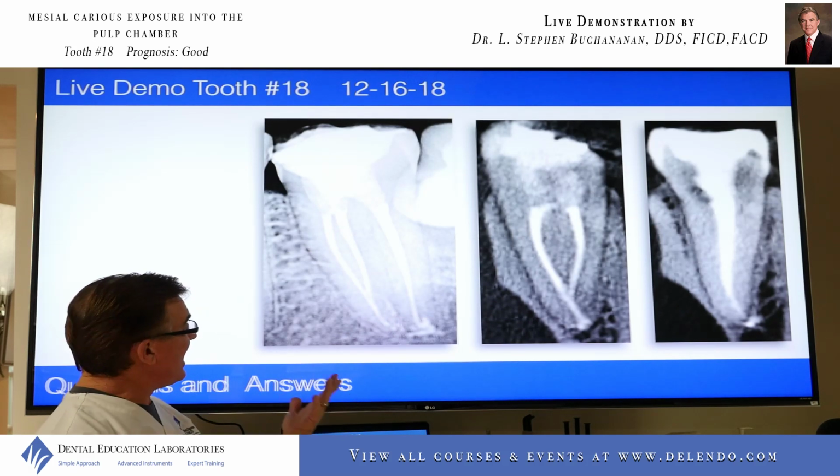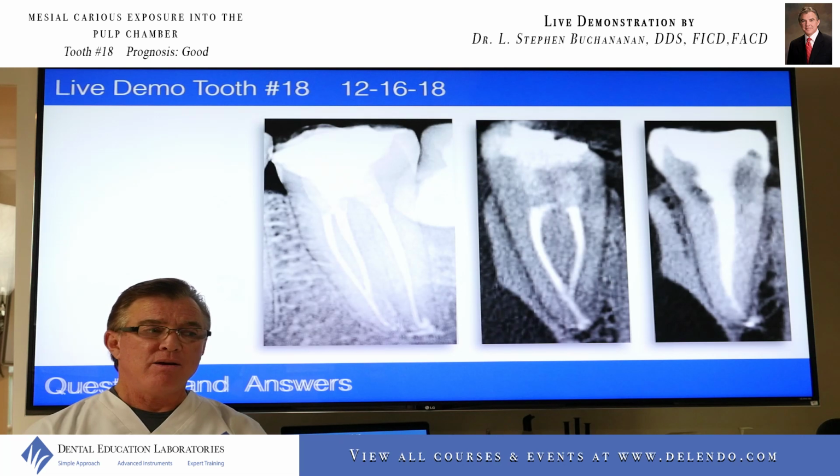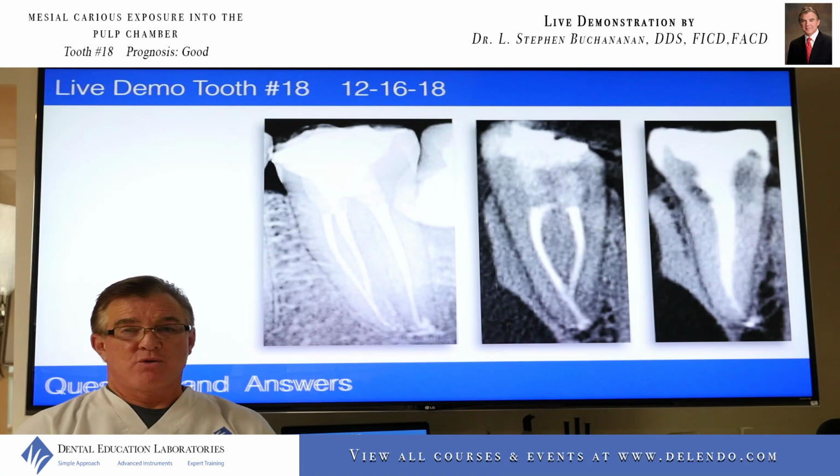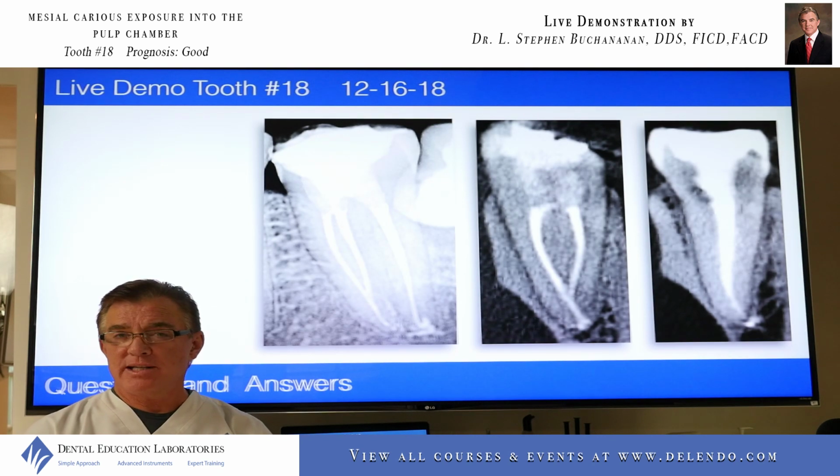But I have personally never seen any sealer in any of the cases I've been working with into the mandibular canal. For the majority of my career until actually this last year, I used Kerr pulp canal sealer, which is ZOE prep, sets fairly rapidly.